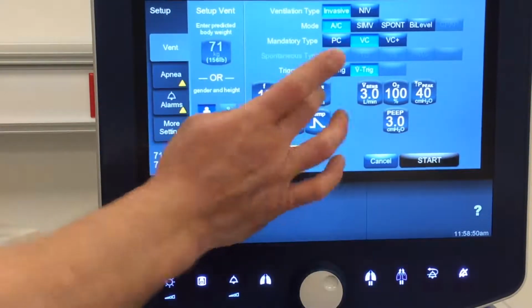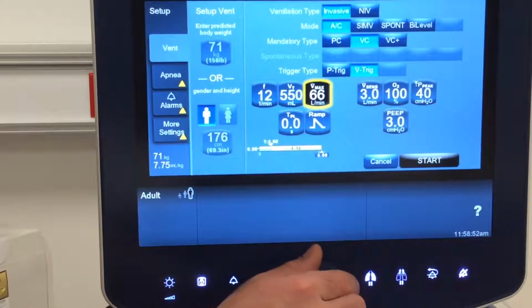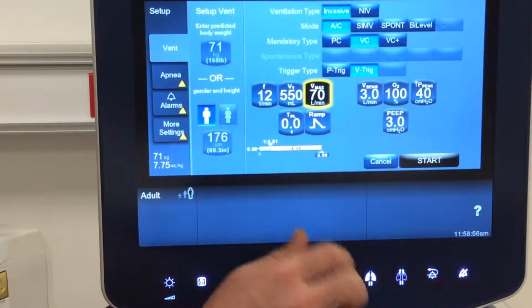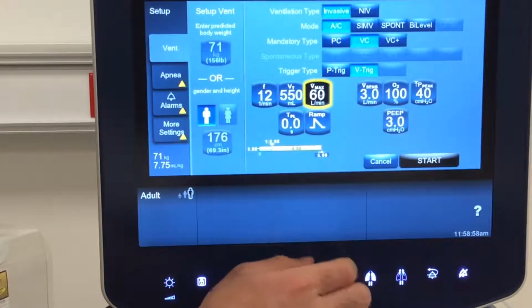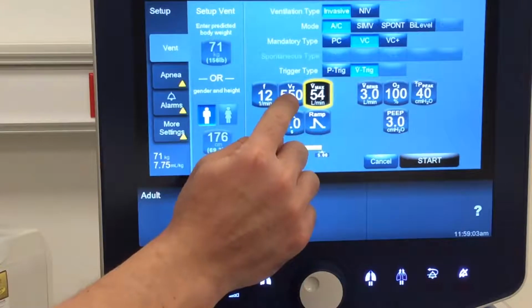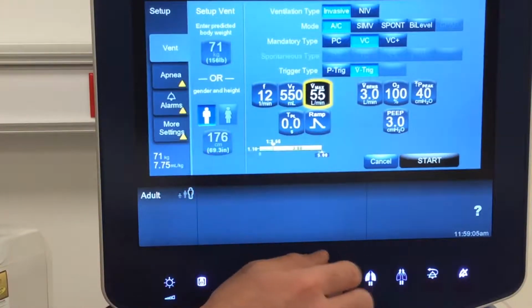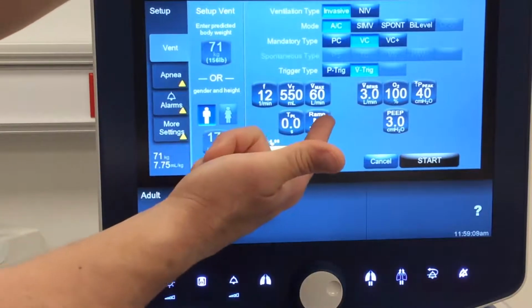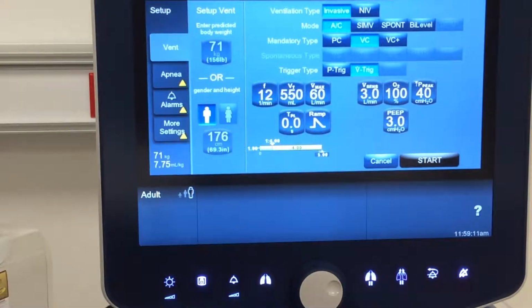And then once again, just to show you, as we go up on the flow, we're reaching 550 quicker, so our inspiratory time actually drops. Likewise, if I slowed it down, I'm going to reach my target tidal volume of 550, but it's going to take a little bit longer to do so, and we're going to play with that quite a bit. In volume ventilation, we have the ability to not only set that peak flow rate, but we also have the ability to fine-tune the pattern at which we deliver that flow.